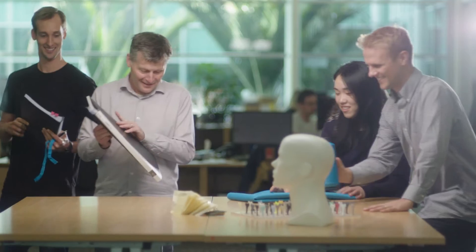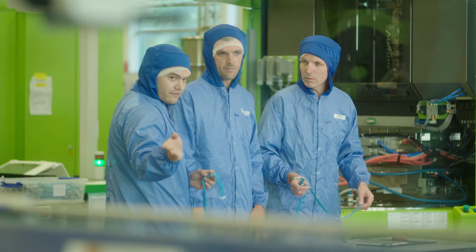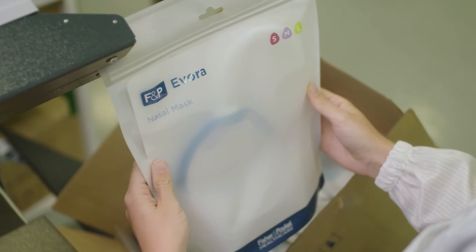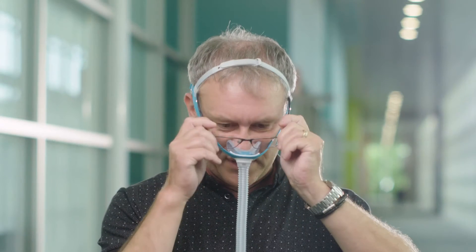Evora is revolutionary, elegant and simple. It's just so easy and that's what sleep should really be. It's really about putting care into every decision we make to ensure that we're creating the best products we can. It's so easy and so comfortable. As simple as that.